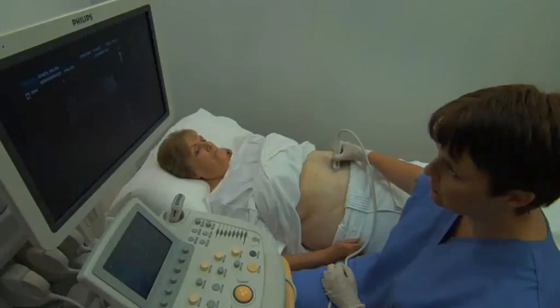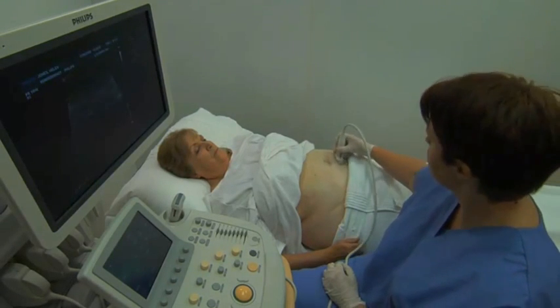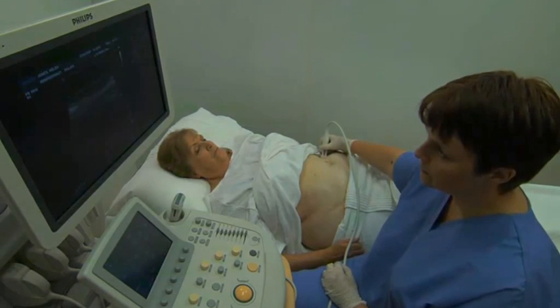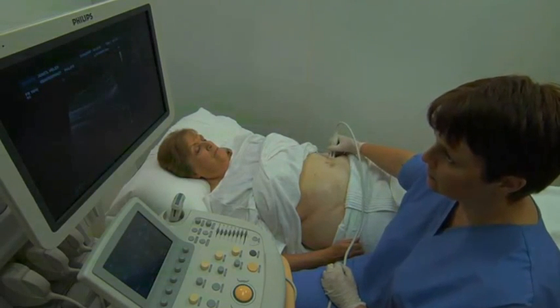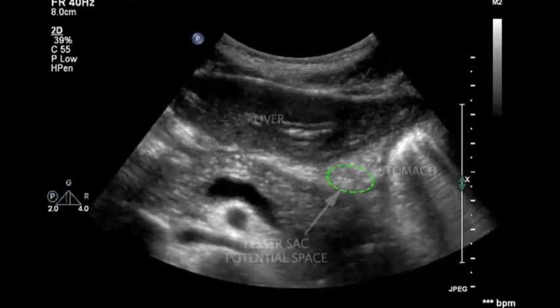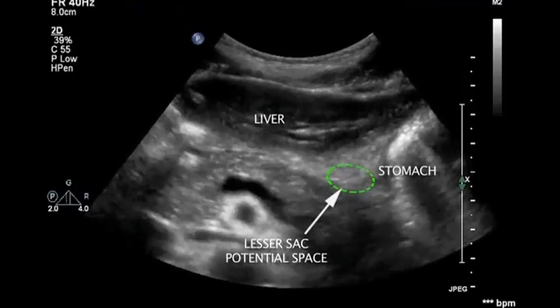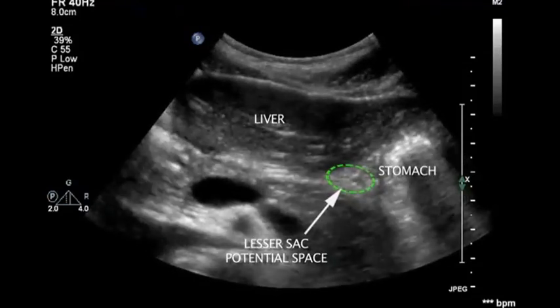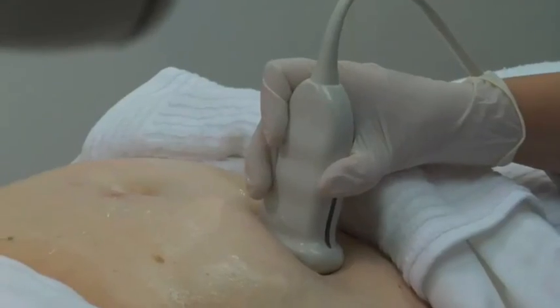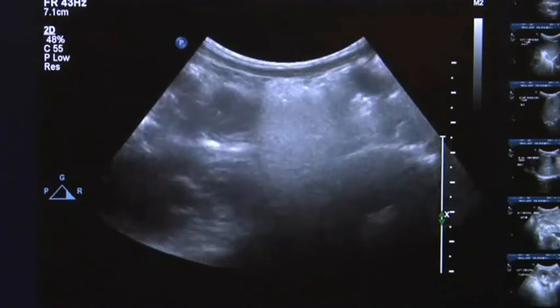There are two main regions of the peritoneum: the greater sac and the lesser sac. Identify any fluid lying in the lesser sac by scanning to the left of midline from mid-liver down to the iliac crest. If fluid is seen in the lesser sac, measure the collection in three dimensions.